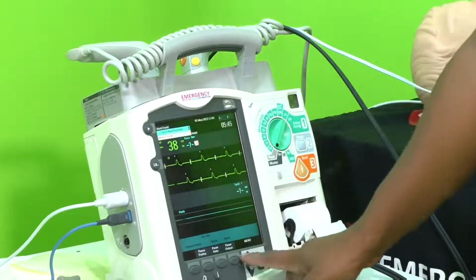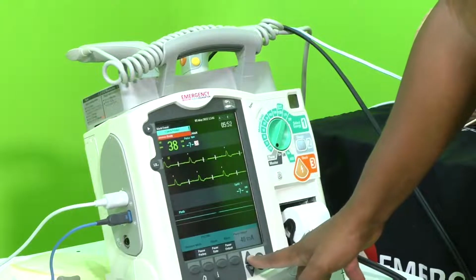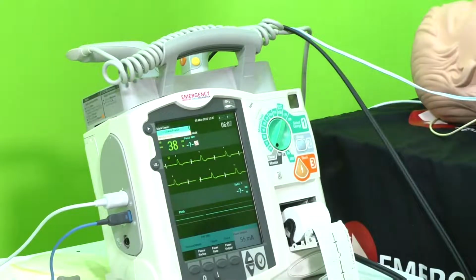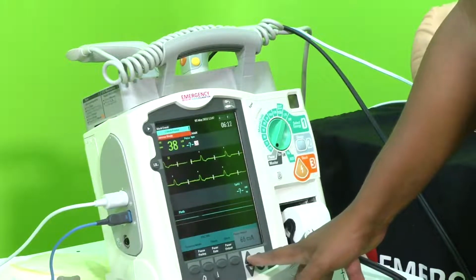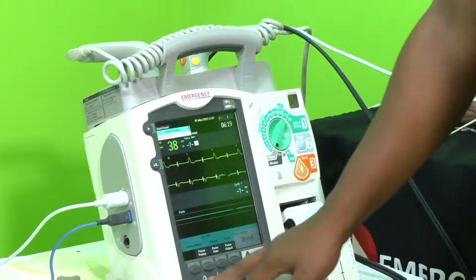So I'm going to increase my output and we'll just increase it slowly. I'm at 35 now. I'm at 40. Every spike must be followed by a wide QRS complex. I go up. I go up. We've already provided analgesia and sedation for my patient, because at this point the patient's going ouch, ouch. I'm going up. Ideally I just want to see a spike and a wide QRS next to it, and perfect. There we go.